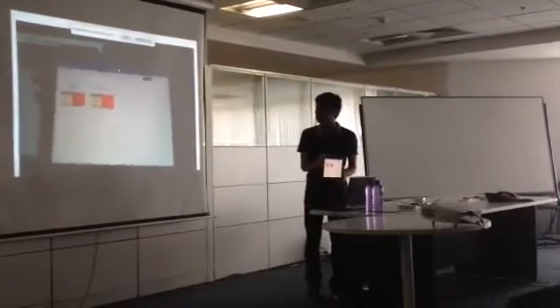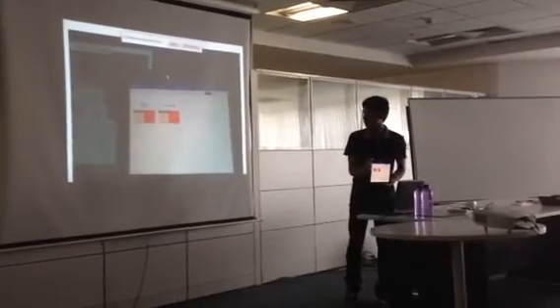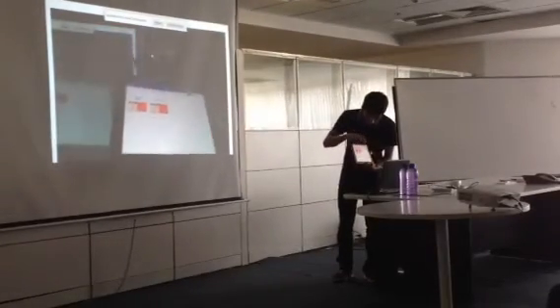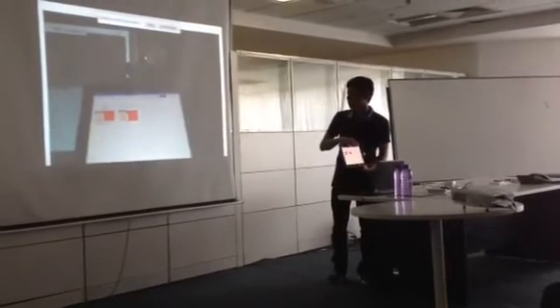So you have several squares on the screen, and the squares represent the patients that are available for the clinician to view. As I said before, these tabs on the top represent the reporting and in-progress patients.